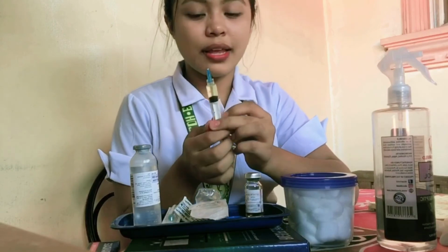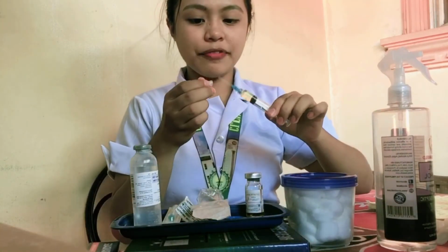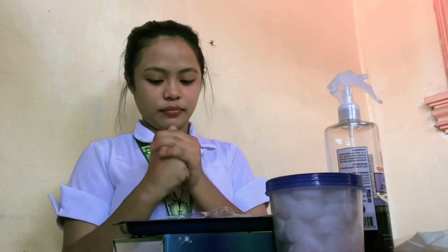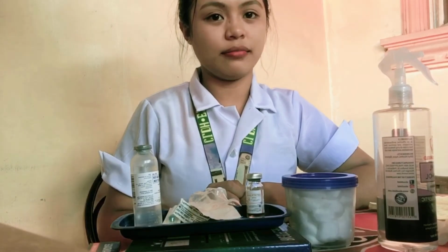After getting 2 ml from our vial, we put the cap on the syringe. After our preparation for our medication, we need to perform hand hygiene. And now we can proceed to our patient and inject the medication. So that's how I demonstrate to you the administering of medication from a vial.